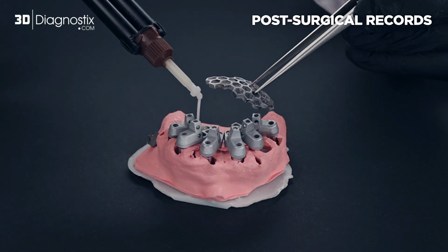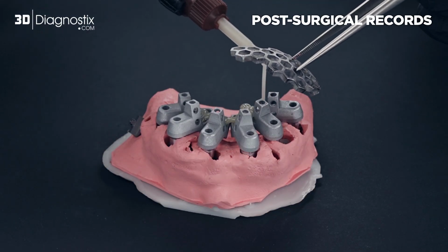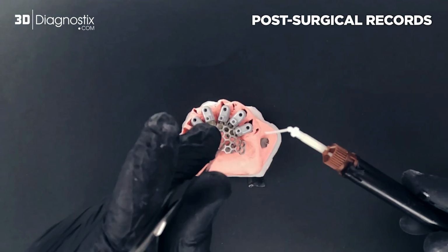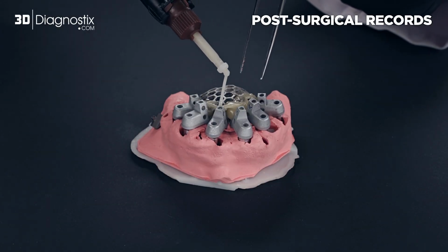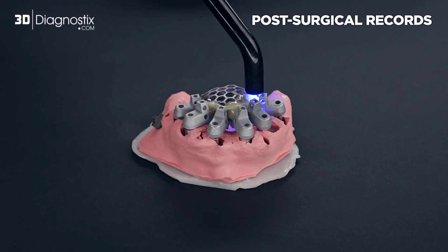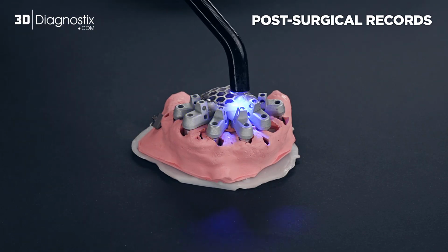Then choose the honeycomb frame that best reaches all scan body wings. Secondly, lute the frame to the scan bodies using a low shrinkage dual curing composite luting cement, essentially the OptiWeld, and then cure with light. Ensure that the luting cement does not touch the scan portion of the sandblasted OPTISPLINT scan body.